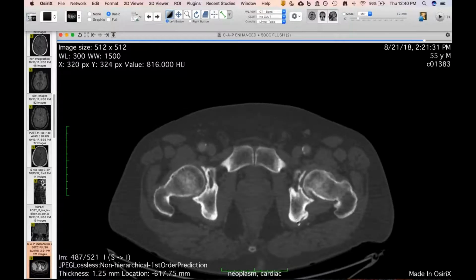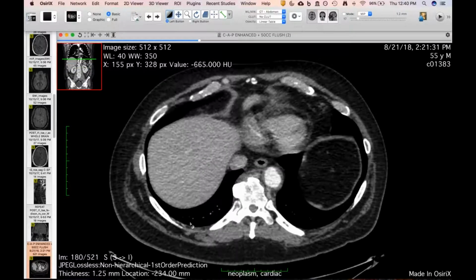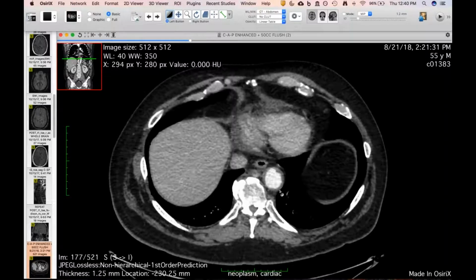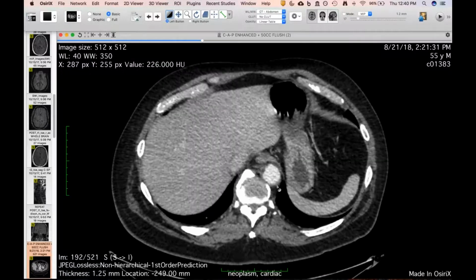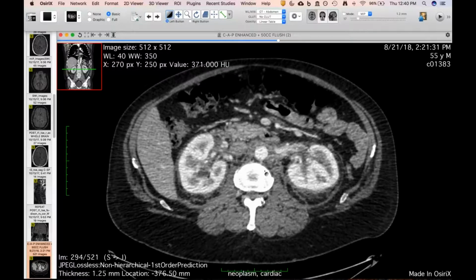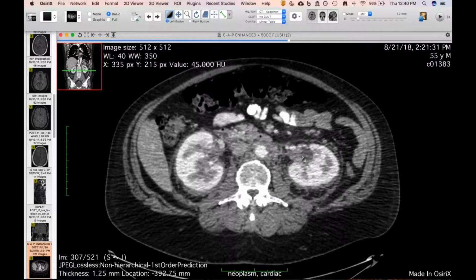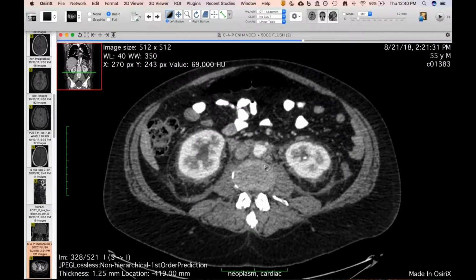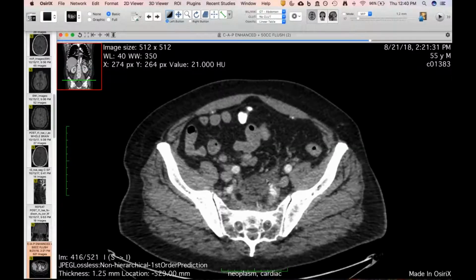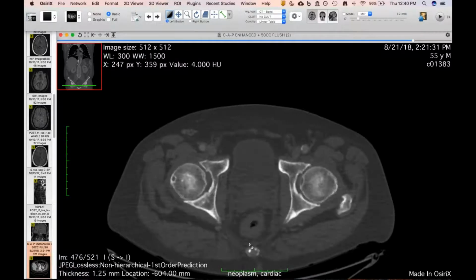So Travis, was there a halo around the descending aorta there in the lower chest? There's not. I think this is mostly just atherosclerotic disease. I think in the abdominal aorta, there's a little bit of lines of soft tissue back here. Certainly in the abdominal aorta, there's some retroperitoneal stuff you can see. And I think to distinguish it from retroperitoneal fibrosis, there wasn't a lot of deviation of the ureters like you would typically see. But now I know the next question would come from you guys, as normally does during this discussion, is what do the long bones look like? How you get the sclerosis.